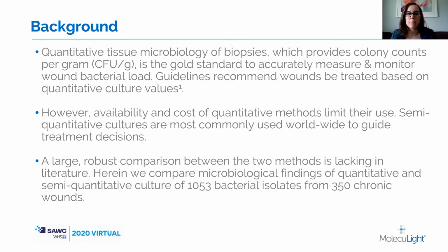Quantitative tissue microbiology of biopsies, which provides colony forming units per gram information, is the gold standard to accurately measure and to monitor wound bacterial load. And guidelines recommend that wounds be treated based on these quantitative culture values.